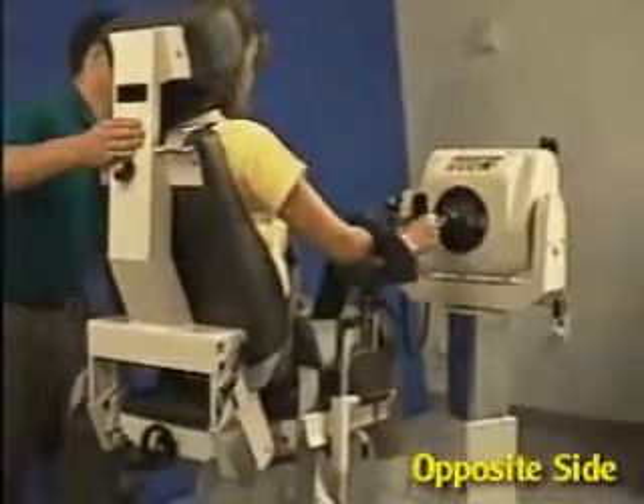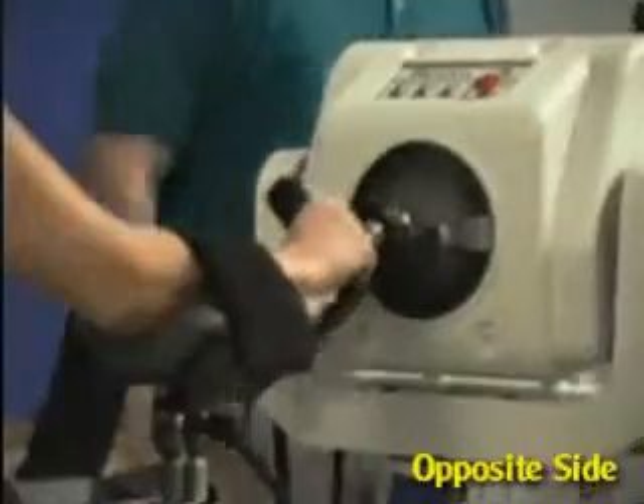Move patient into position and set range of motion stops.